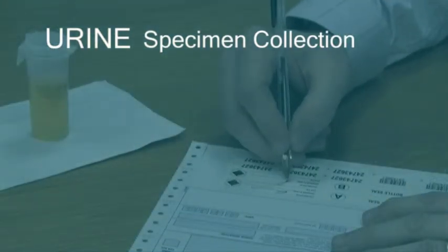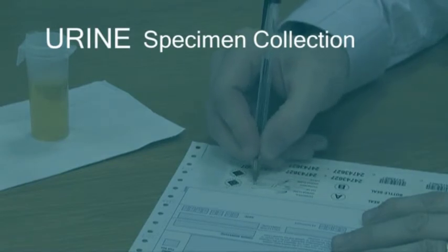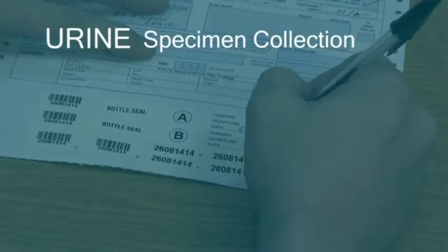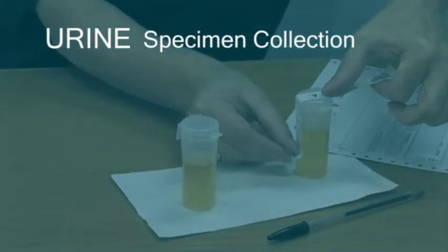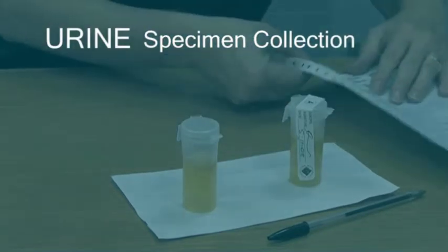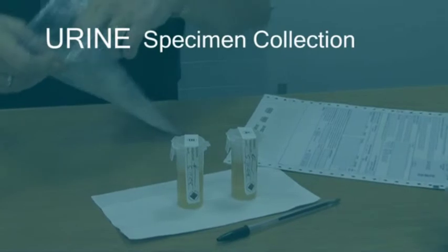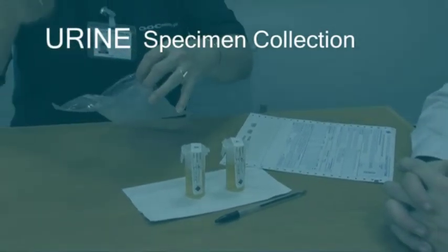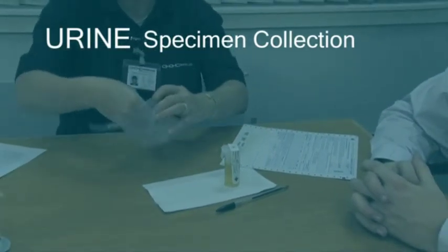Keeping the 2 bottles in view of the donor, take the chain of custody form and ask the donor to sign and date the 2 tamper evidence seals, labelled A and B. Watched by the donor, carefully place the seal over the cap of the bottle and down both sides. Now place both bottles in the indicated pocket of the chain of custody bag. Do not seal the bag yet. You have to complete the chain of custody form first.